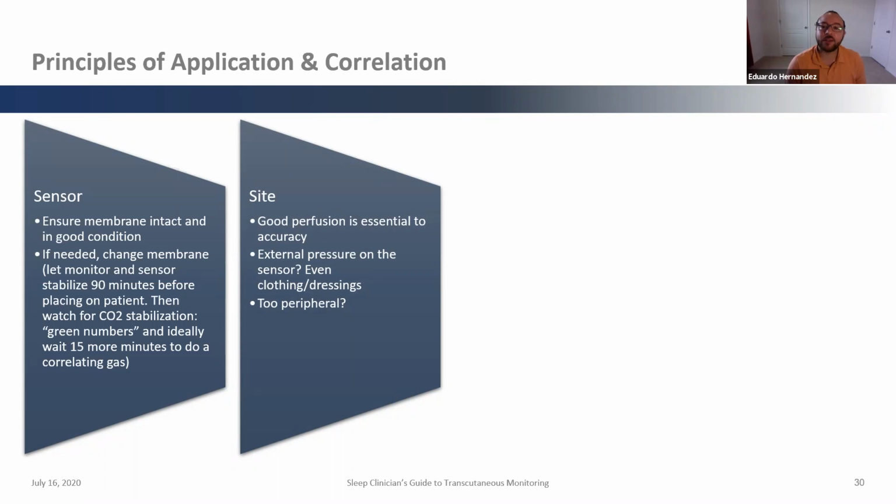Keeping in mind again, if this patient is more prone to moving around a lot at night. Many times in adult labs, there's almost a component that you have to keep them on their back as long as possible, which is very difficult for adults, especially with obstructive sleep apnea. We all know why, what the gravity does to the airway, that kind of thing. So you want to make sure that you keep in mind your type of patient when you're selecting the site.